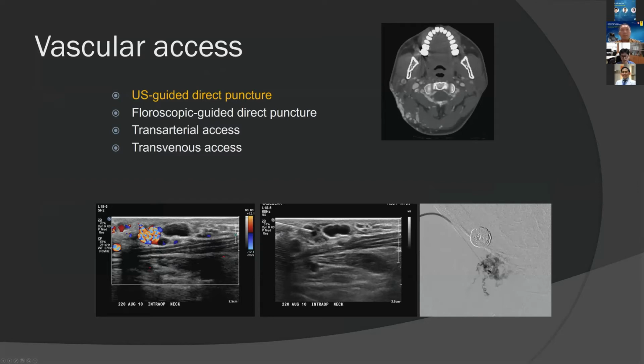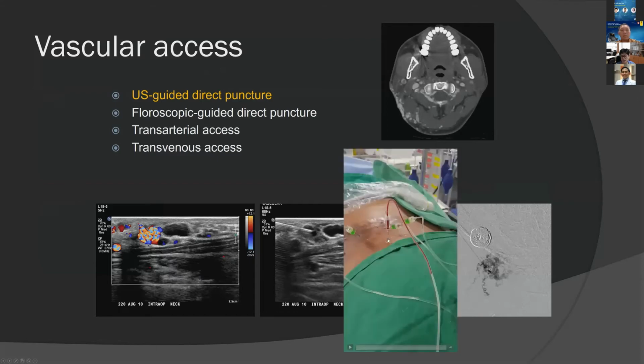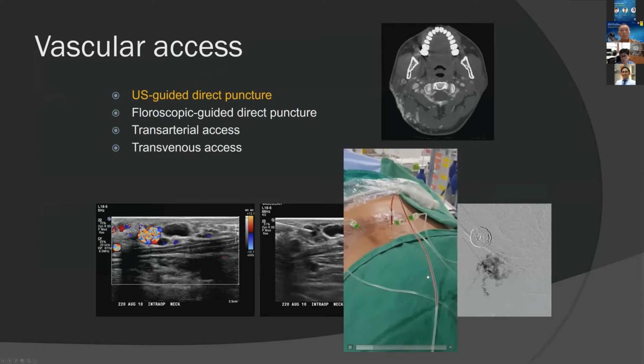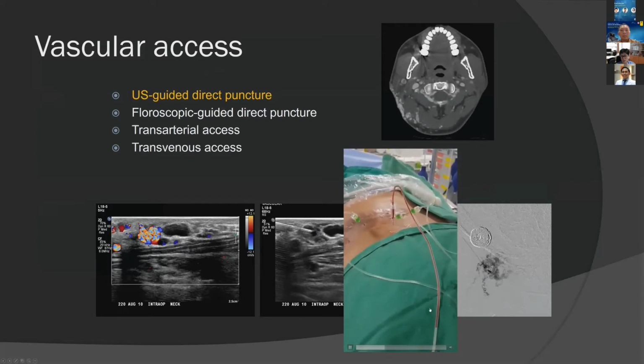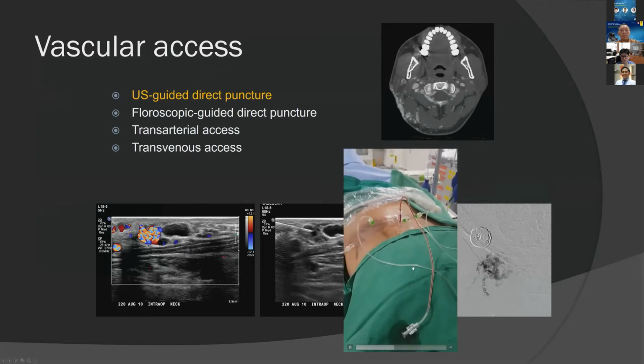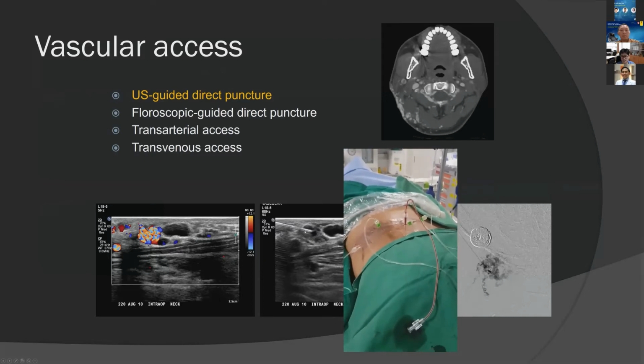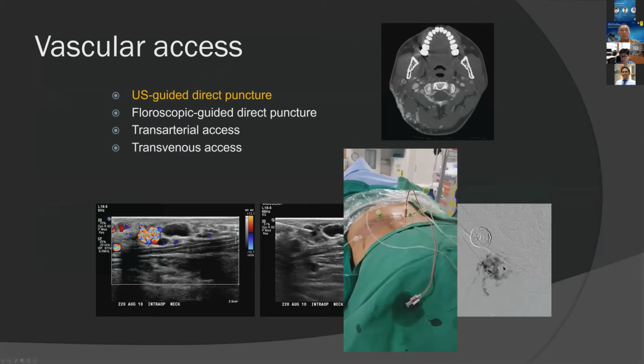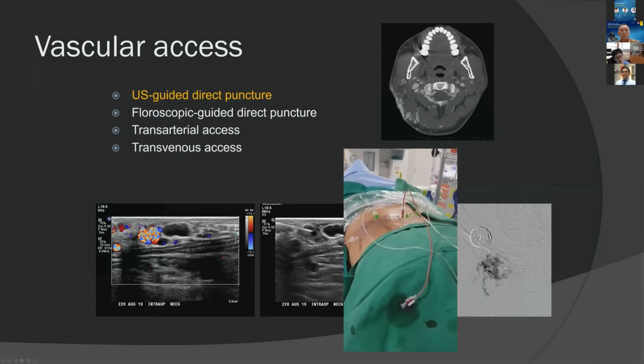After identifying the target lesion, a small needle is inserted in the nidus, then blood spontaneously comes out from the needle. This means the correct puncture of the nidus. Then we check angiography, and we can use ethanol or other embolic material very safely.